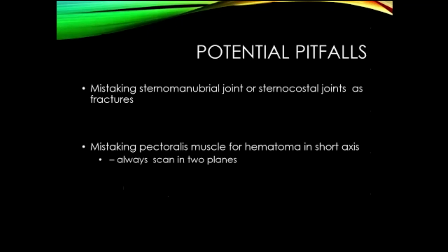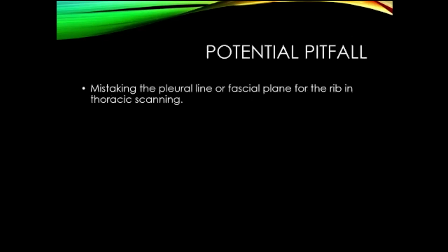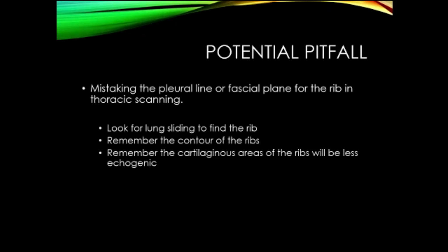So potential pitfalls: the sternocostal joints and the sternal-manubrial joint. And then you can also mistake the pectoralis muscle for a hematoma in short axis. I haven't actually looked at this, but there are a couple of times this is cited in the literature. And another pitfall is mistaking the pleural line or flat fascial plane for the rib in thoracic scanning. So look for the lung sliding to find the rib.